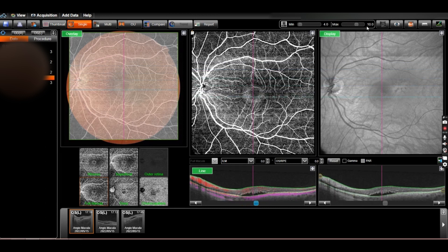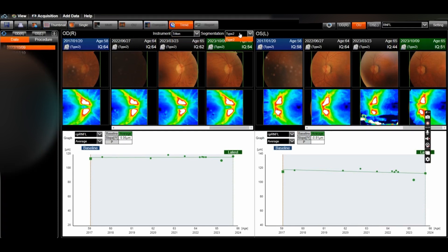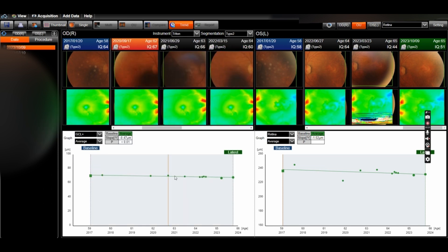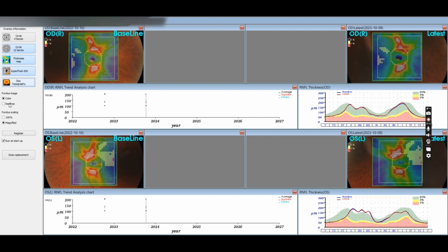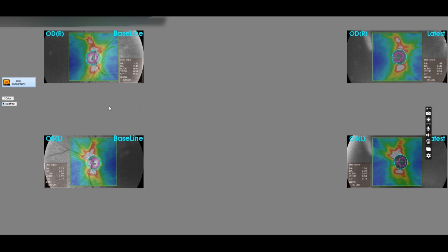When it comes to glaucoma, ImageNet has plenty of built-in features for comparing multiple visits. You can change between GCL and RNFL — it's all displayed, and no matter how many visits you've had you will have a nice graph showing changes in RNFL or any other optic nerve head and glaucomatous parameters. It's all built in; you don't need special equipment or extra licenses. However, some of these comparison options are also present in the Triton software, though there you don't have as many images of the optic nerve and fundus photo for comparison.